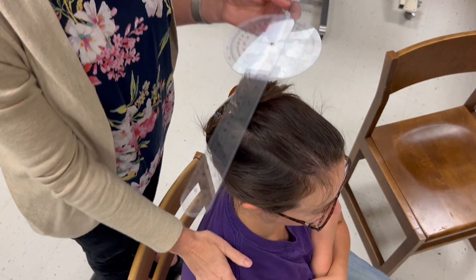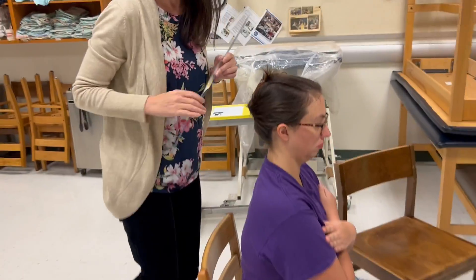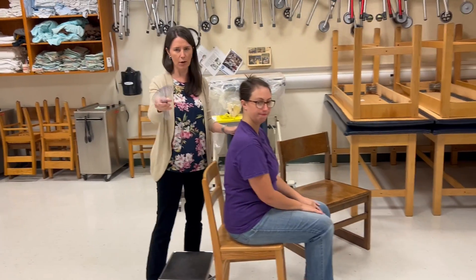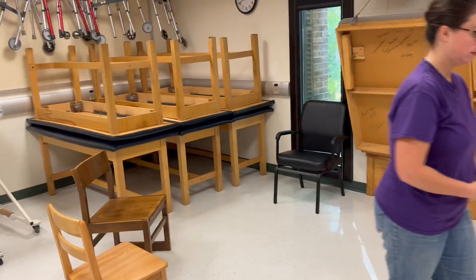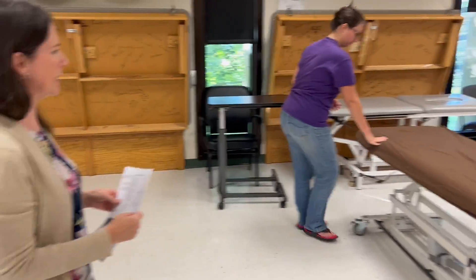Now we are going to do some MMT for trunk rotation, so we're going to head over to the table. I'm going to have the patient lie on their back.